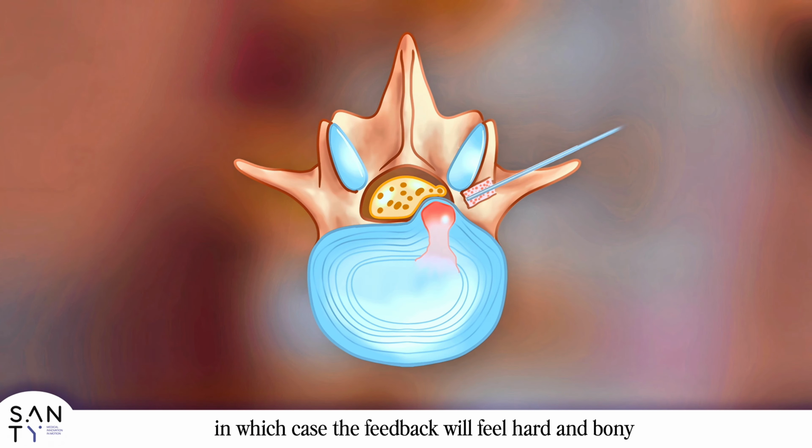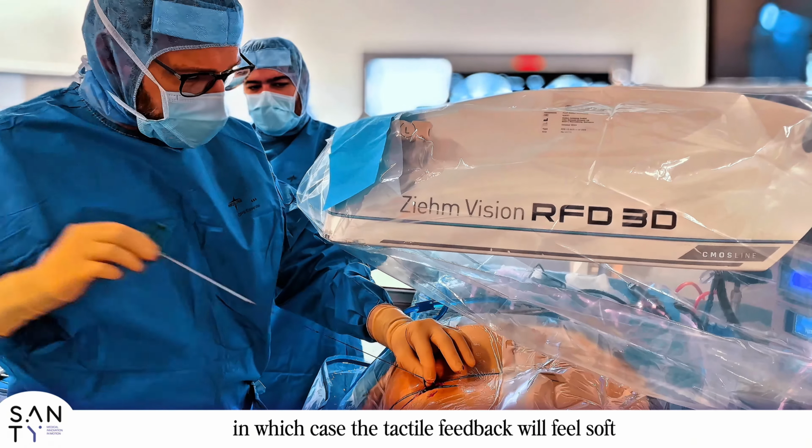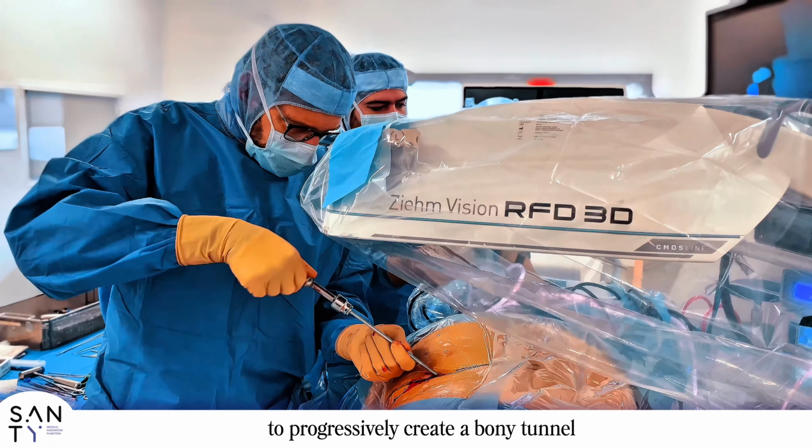the SAP, in which case the feedback will feel hard and bony, or whether the medial cortical wall of the SAP has been breached and the wire has entered the foramen, in which case the tactile feedback will feel soft. Sequential reamers of increasing size, typically 3, are then passed to progressively create a bony tunnel through the SAP.